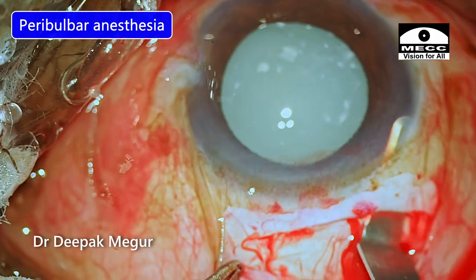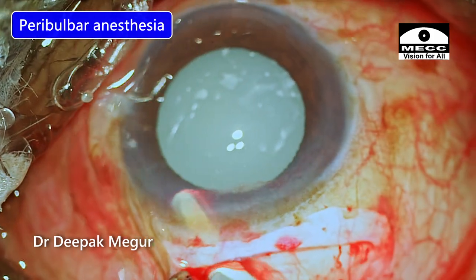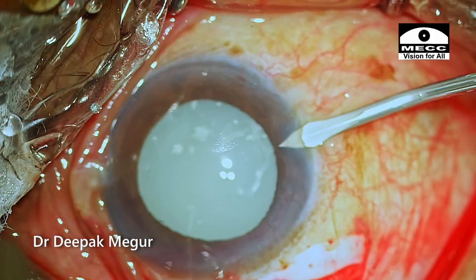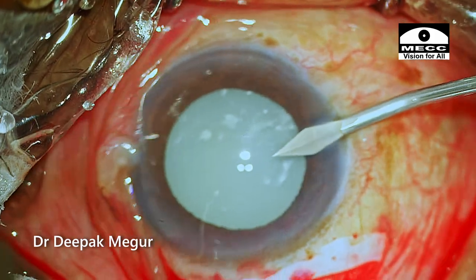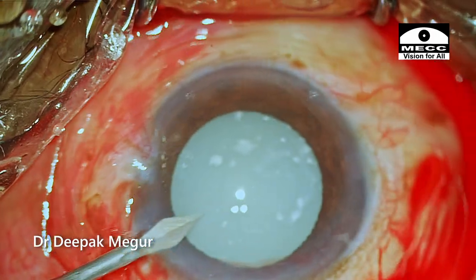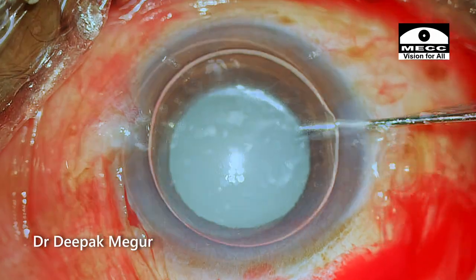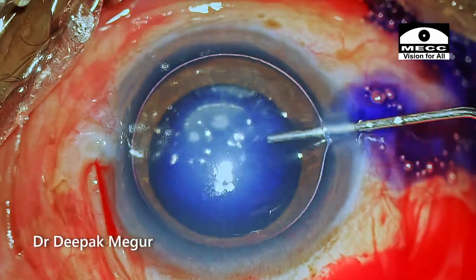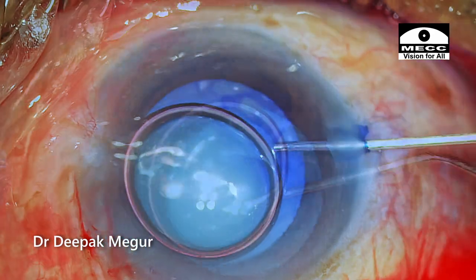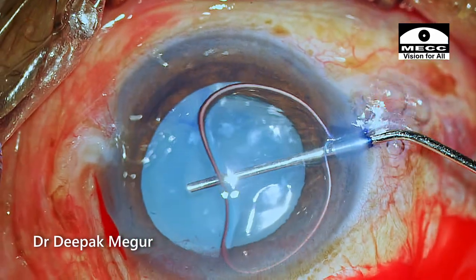The case is being performed under peribulbar anesthesia. I've created the scleral tunnel and I'm entering the eye by making two side port entries. The capsule is stained, and OVD is injected into the eye to pressurize it.